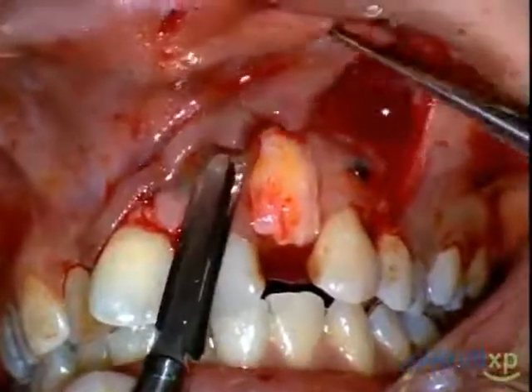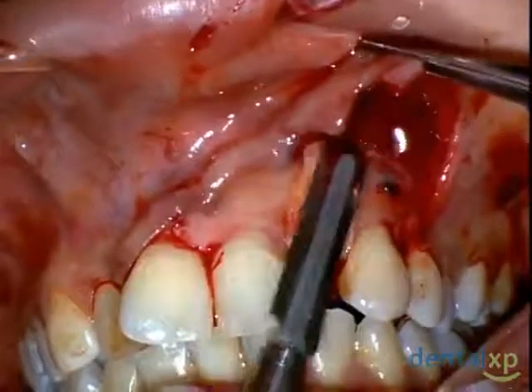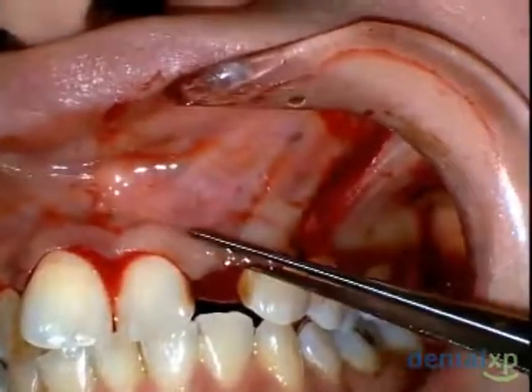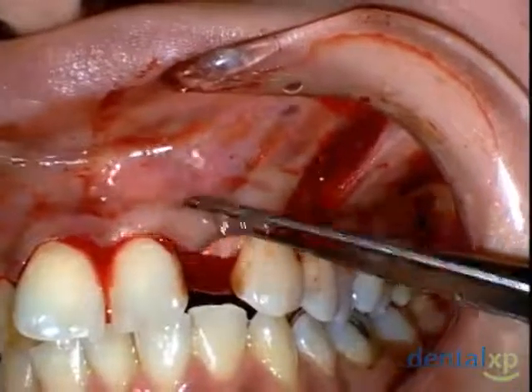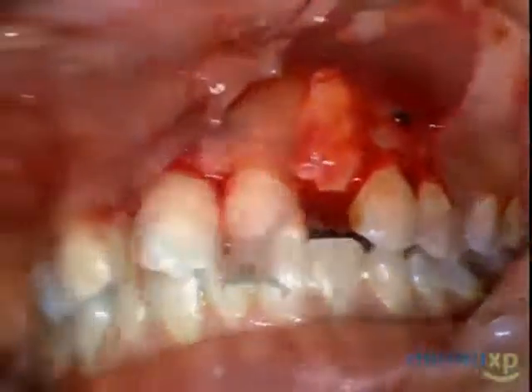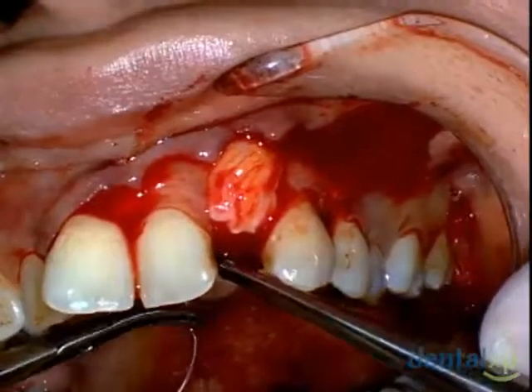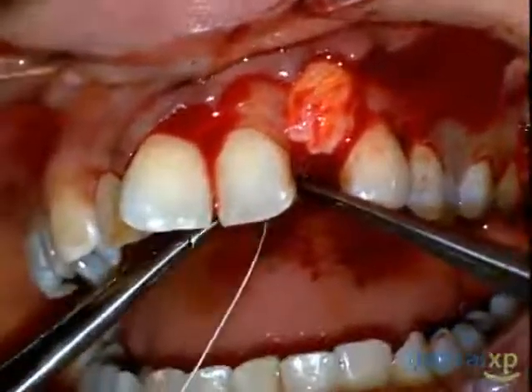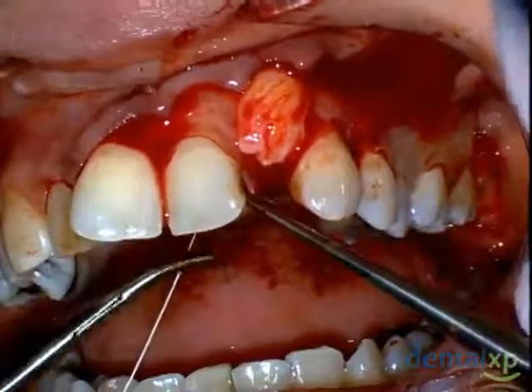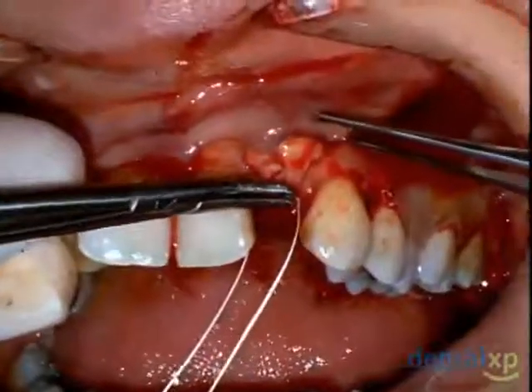And here you can see us doing split thickness dissection beyond the mucogingival junction, where we have elastin fibers incorporated into the flap. We want to make sure that this flap will be easily moved in a coronal position, and coronally positioning this tissue over the augmented tissue and membrane is extremely important to the long-term success. Once we've created the split thickness dissection, we then can go ahead and utilize Gore-Tex sutures. These are polytetrafluoroethylene or PTFE sutures that are inert and can stay in for quite some time.